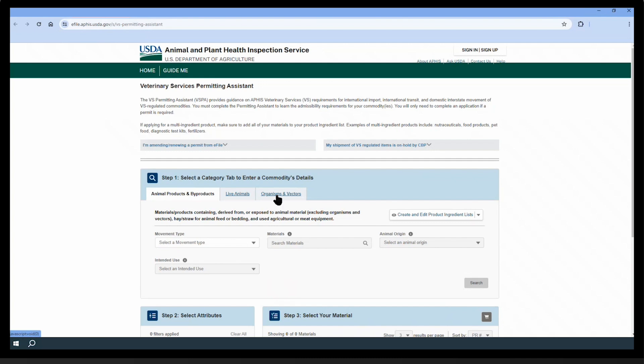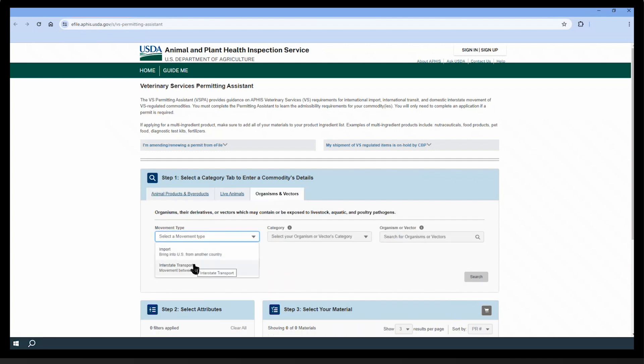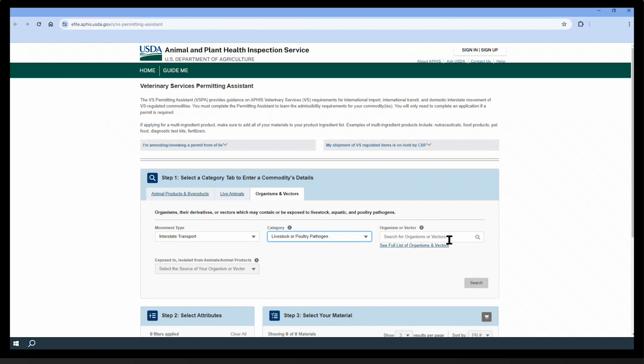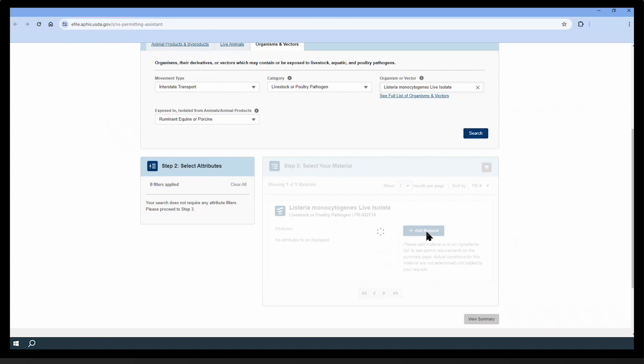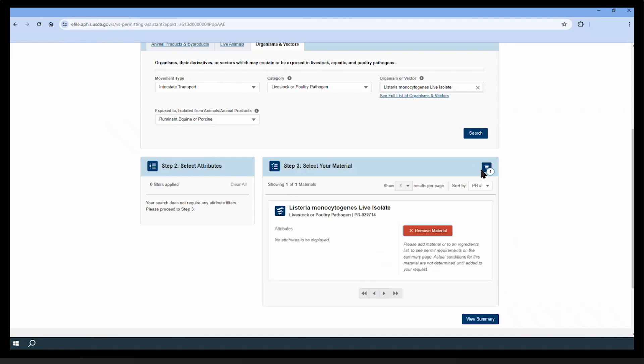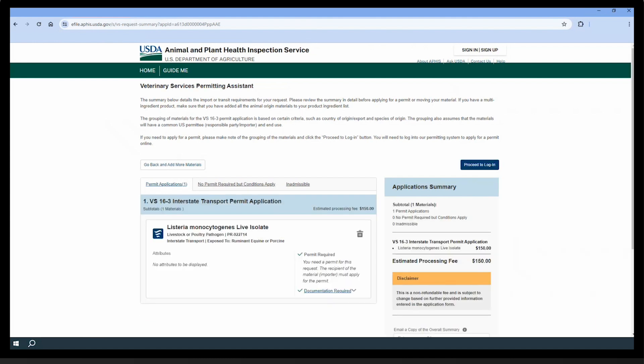Follow the list of organisms and vectors. Then go to movement type and select interstate transport. Under category, choose, for example, livestock or poultry pathogen. Then select an organism — for example, Listeria monocytogenes as a live isolate. Under exposed to or isolated from, you can choose, for example, ruminant, equine, or porcine. Press search and the species will appear below. Click add material to add it to the basket. After choosing all the needed species, press the basket icon and all selected species will be listed. You will see more details and whether a permit is required. In that case, you will see the estimated processing fee. You can then click proceed to login to finish your order.